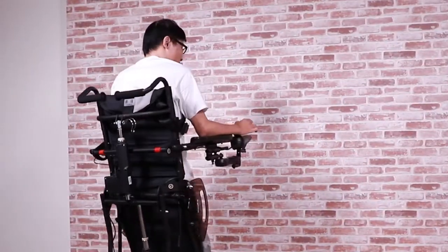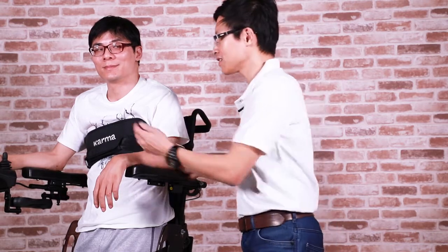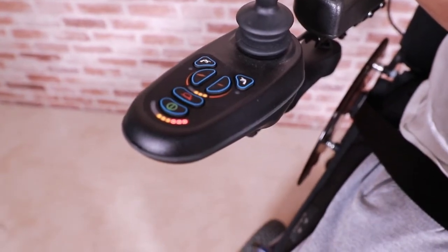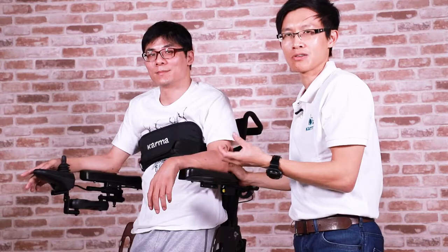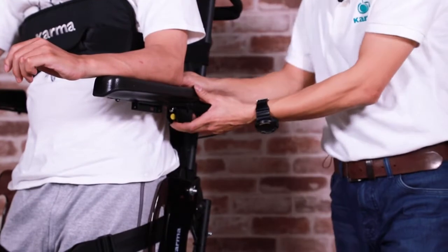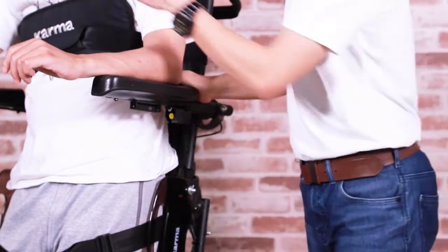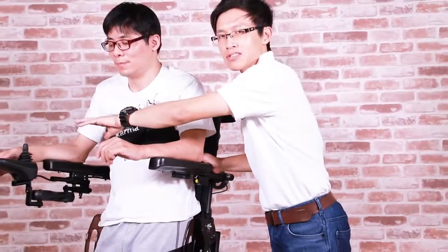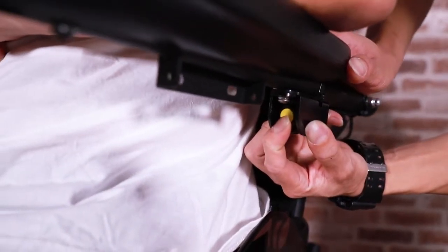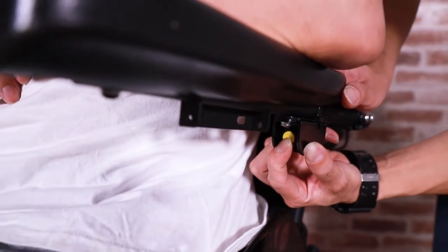Ergo Stand has several safety designs. First of all, the controller will reduce the driving speed by half while the chair is in a standing position for safety reasons. Secondly, there is a yellow button located underneath the armrest. This button is designed to provide an alternative command to the chair to sit down in case of emergency. For example, if the main controller shuts down, simply press and hold this button. The chair will come down slowly.